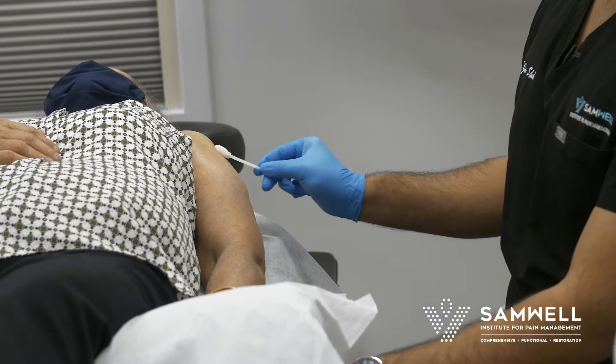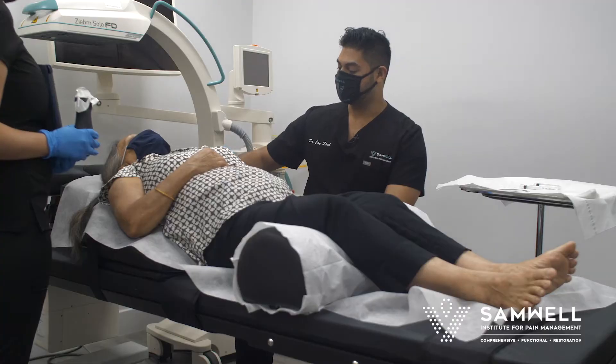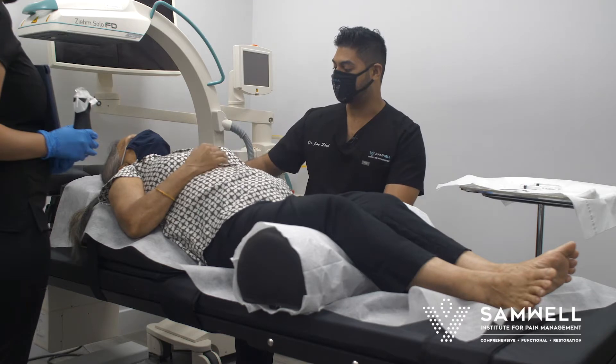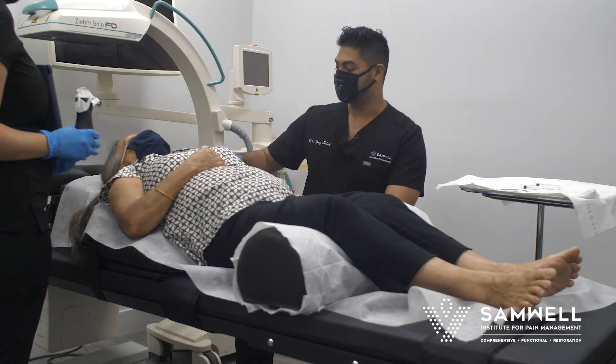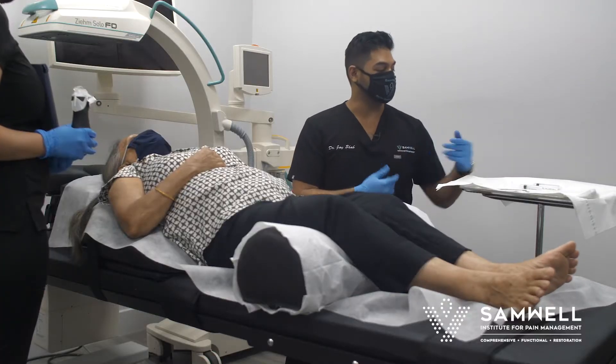This can cause pain and inflammation where the rotator cuff impinges on one of the other shoulder bones. It's a quick one to two minute procedure that can provide relief for a very long time for that inflammation, and gives things in the shoulder time to heal with relative rest to really calm down the painful issue.